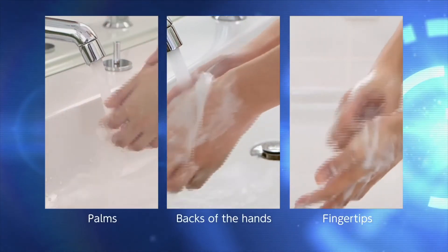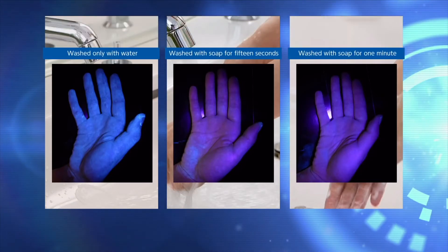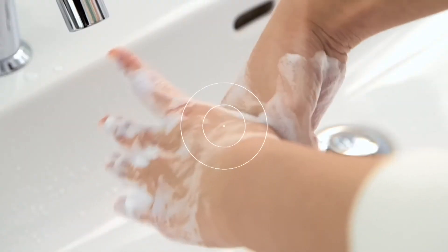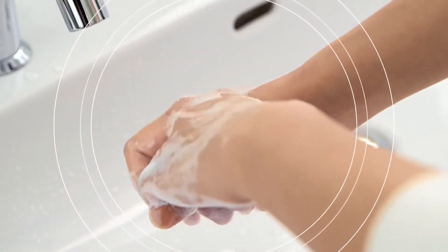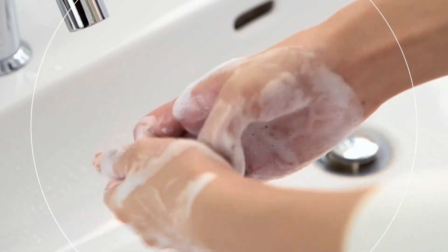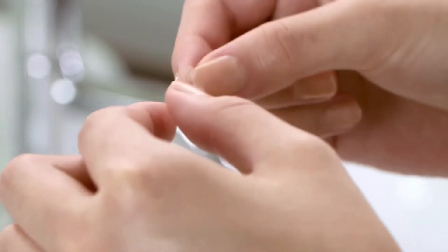Washing your hands is important for protecting your eyes. Proper hand washing is fundamental to the proper application of contact lenses. In the entire process of applying contact lenses, it is essential to protect your eyes from debris.